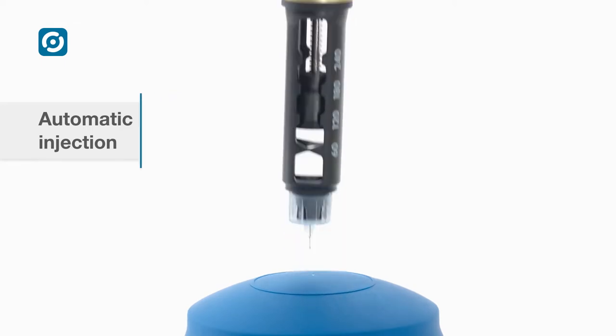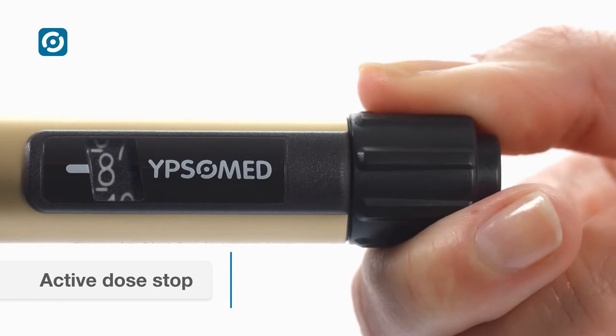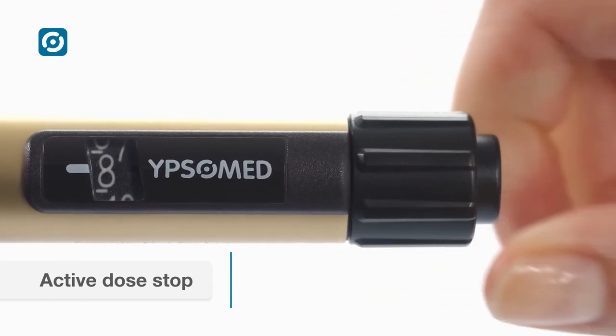The active dose stop only allows the dialing of a dose up to the volume of drug remaining in the cartridge, ensuring correct dosing up to the last unit.